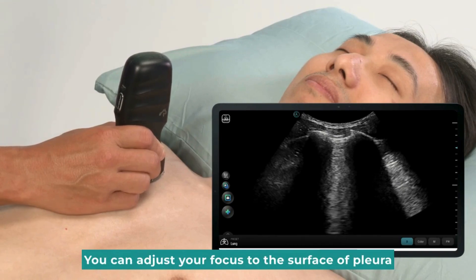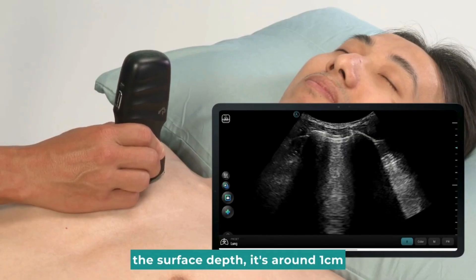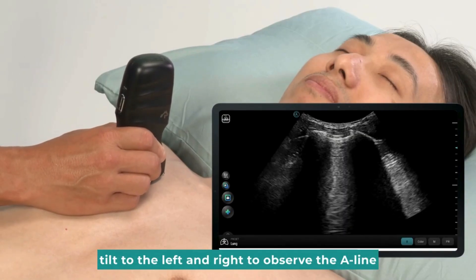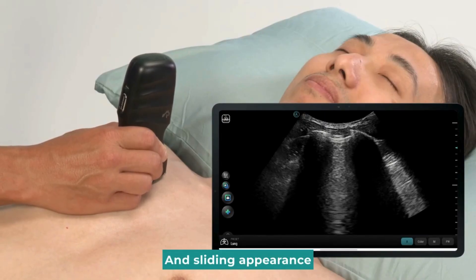You can adjust your focus to the surface of the pleura. The surface depth is around 1 cm. Tilt to the left and right to observe the A-line. A normal pleura must have the A-line and sliding appearance.